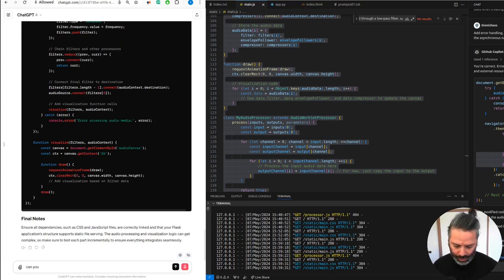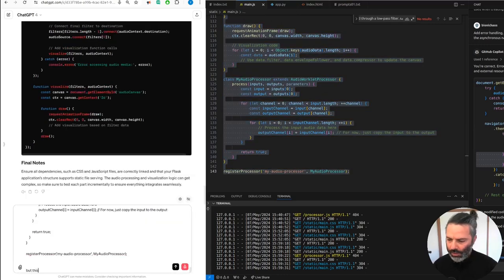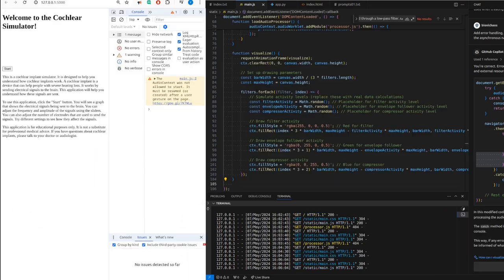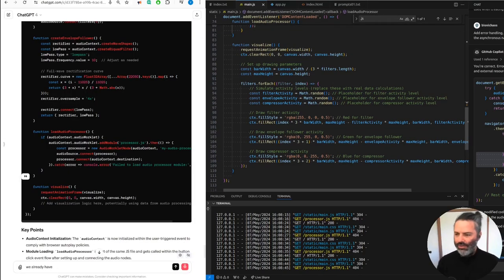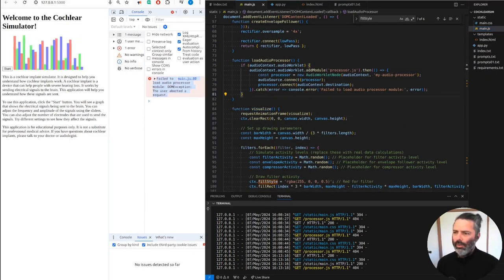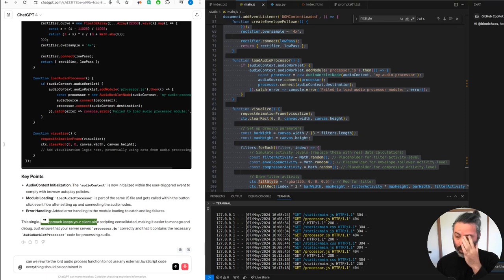Can you regenerate the complete updated JavaScript? This is what I currently have. But this code requires a total refactoring. Make sure the canvas size is adequate for the number of filters and status you are visualizing. You might need to adjust the bar width and spacing based on the actual number of filters. Yeah, already have visualization logic. Yeah, we'll keep it simple. Can we rewrite the load audio processor function to not use any external JavaScript code? Everything should be contained in this one file.